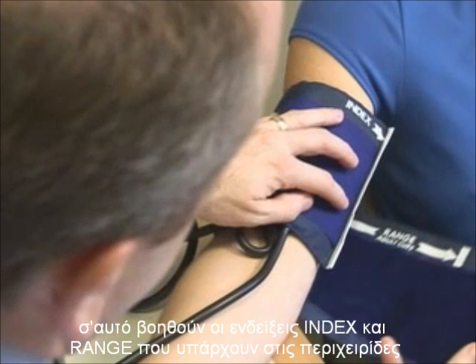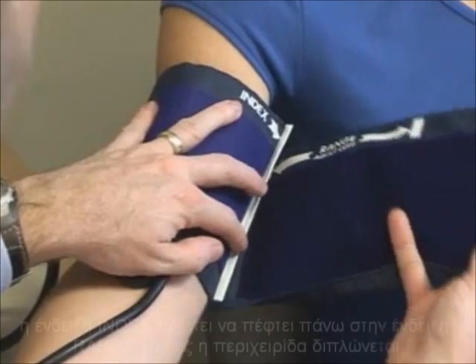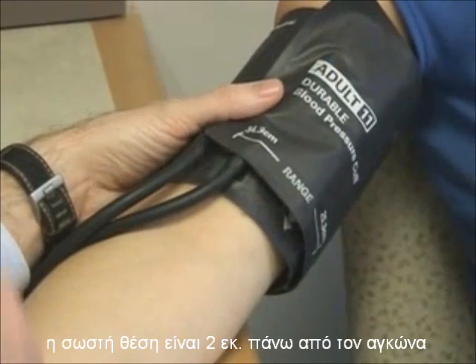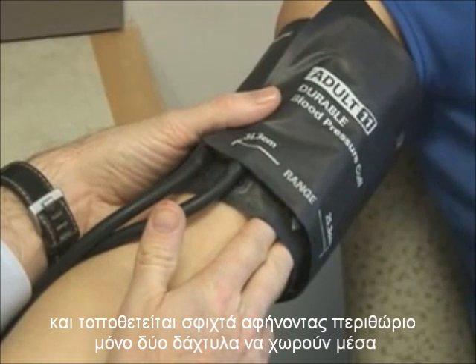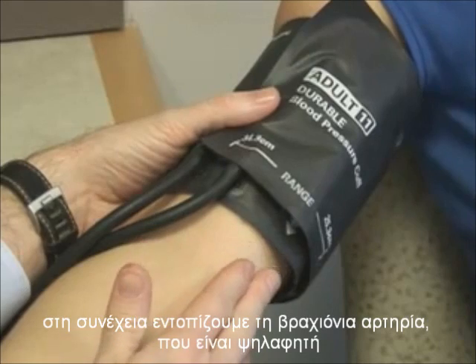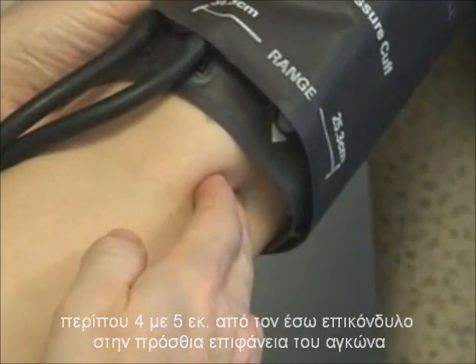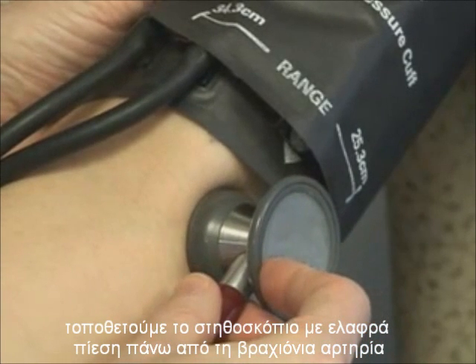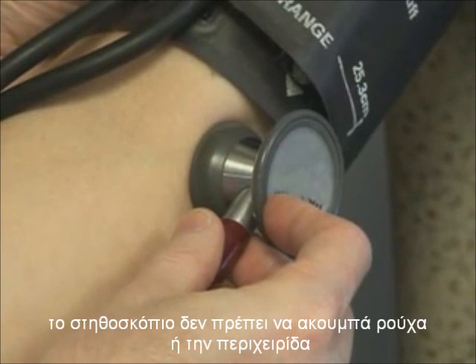To assist in selecting the appropriate size, cuffs should be marked with an index line that runs perpendicular to the length of the cuff and a range line that runs parallel to the length of the cuff. The index line should fall within the range line when the cuff is secured to the upper arm. The cuff should be applied 2 centimeters above the crease of the elbow, and it should fit snugly but still allow 2 finger widths under the cuff. Next, find the brachial artery, which is palpable approximately 4 to 5 centimeters from the medial epicondyle on the anterior surface of the elbow. Place the stethoscope lightly against the skin over the brachial artery with appropriate pressure to ensure good sound transmission. The stethoscope should not be in contact with clothing or with the cuff.